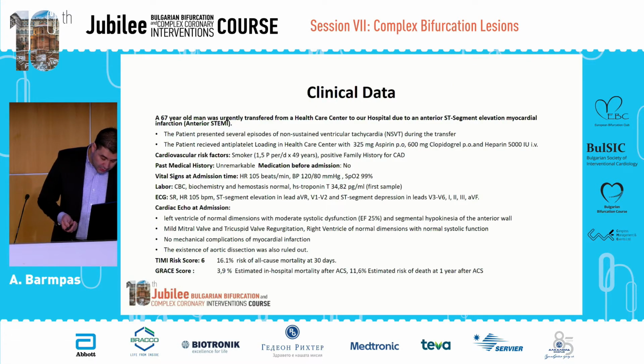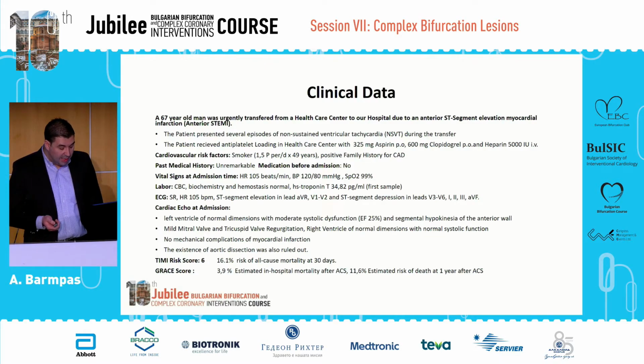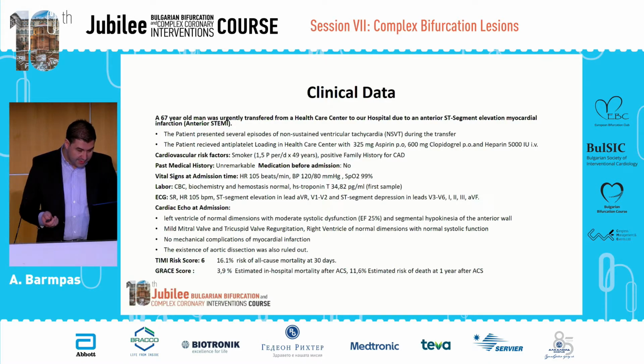And I would like to continue with a case illustrating treatment of a distal left main LAD bifurcation lesion classified as Medina type 1,1,0 in a patient presenting with anterior STEMI. The patient was a 67-year-old man who was urgently transferred from a healthcare center to a hospital due to an anterior STEMI. At presentation, ECG showed poor R wave progression and ST elevation in anterior chest leads. Echo showed severe LAD territory hypokinesia with preserved thickness, but low EF of 25%.